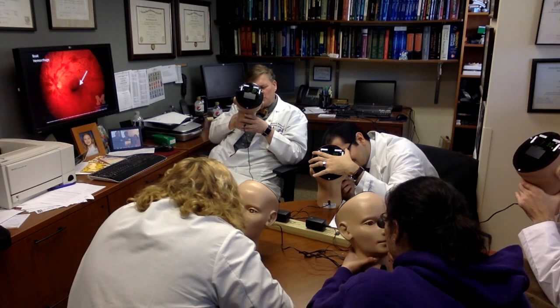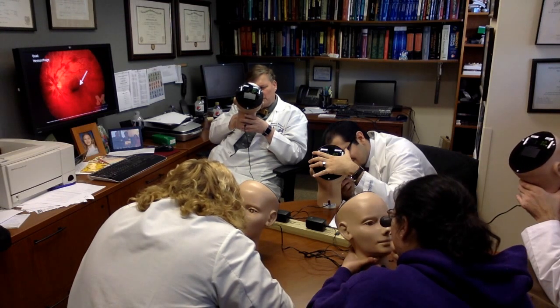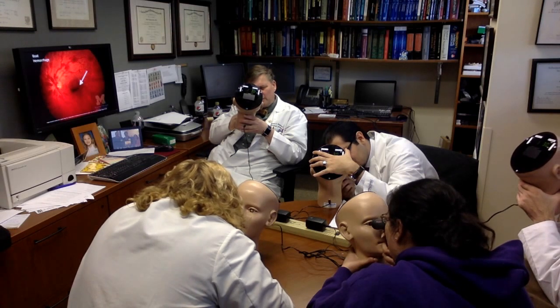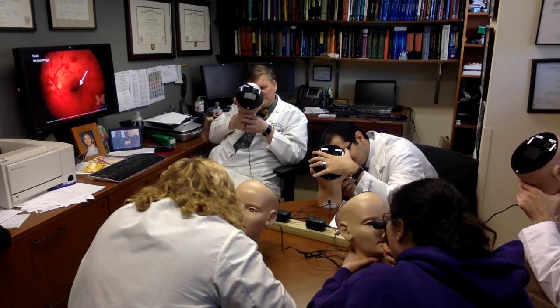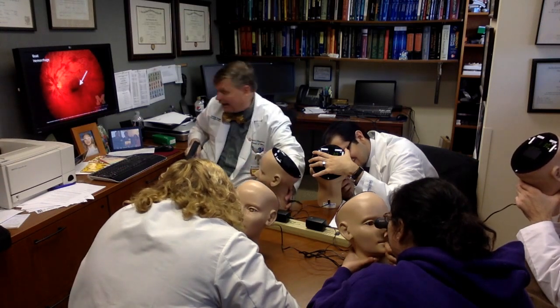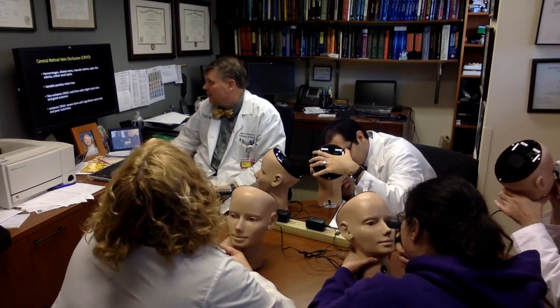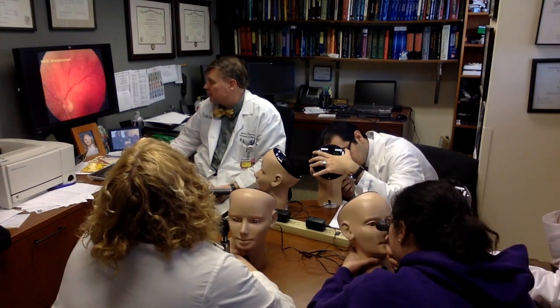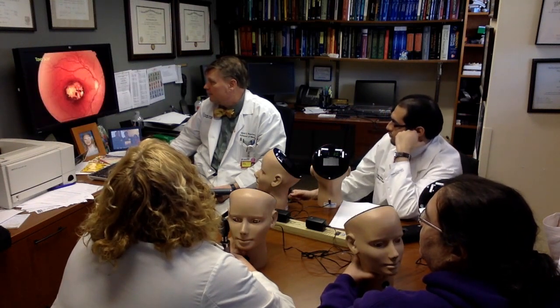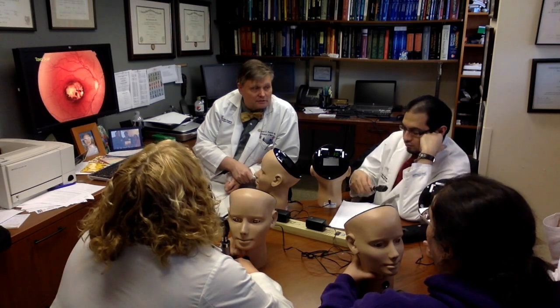Would you agree that it's relatively oval? Yep. Would you agree it's relatively demarcated? Good. And you see in the center there's a lot of pigment right around the outside. This kind of dark pigment, and the middle is white. Do you believe that this is a scar? This is kind of a scar-like thing to you? Okay. These all look the same. And this is a toxo scar. Whoa. All the toxo scars in the retina look the same.